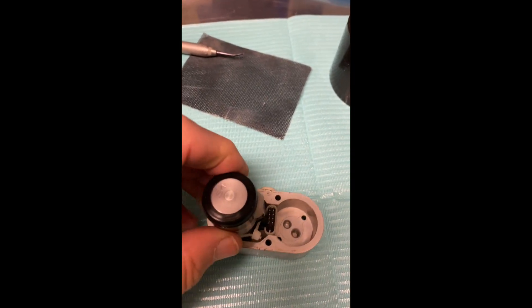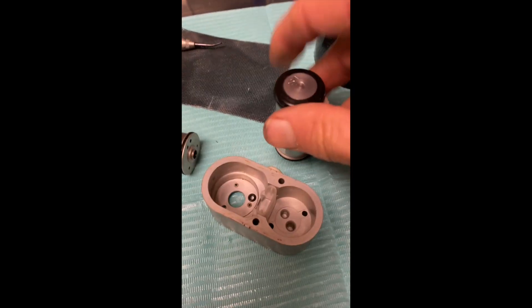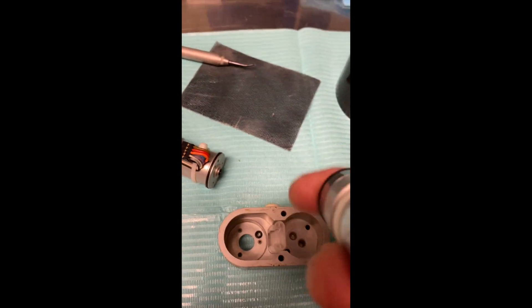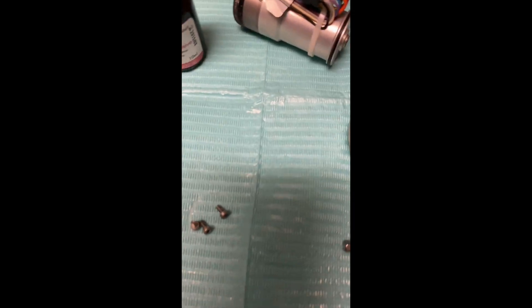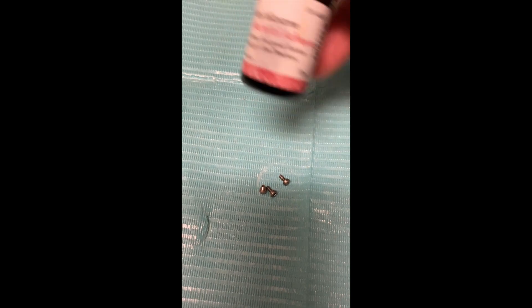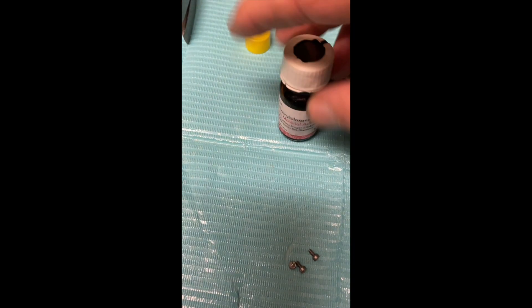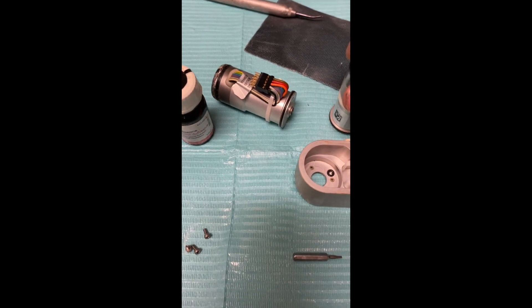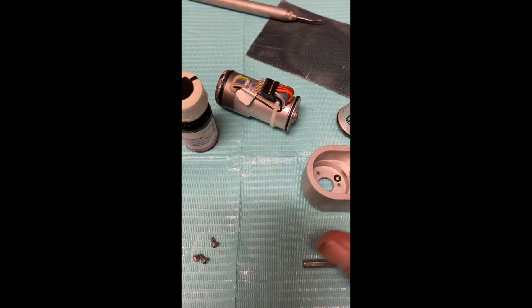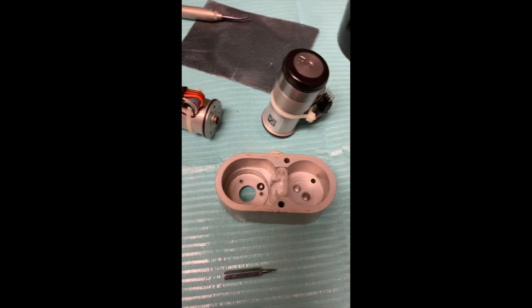Let me take you through this assembly process. This motor pulls out of here like this. Remember that there's a little silicone gasket down here, and you want to line up this hole on this with that, and then the screws are going to go in there. For these little screws, instead of Loctite, I'm going to use a little bit of polyvinylsiloxane adhesive material — just dab it on the ends when I screw this in to help lock it so they don't unscrew. So we're going to reassemble this and put it back on the machine.